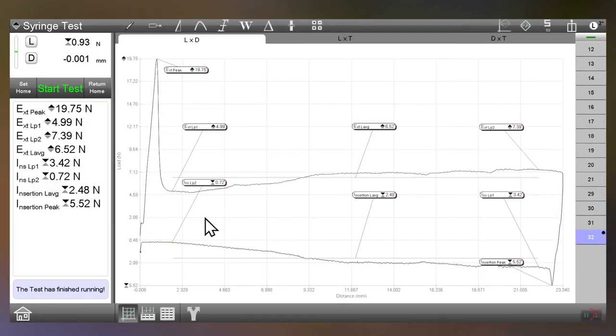It's going to do a calculation for us. So here was our extraction peak. Here's our insertion peak.